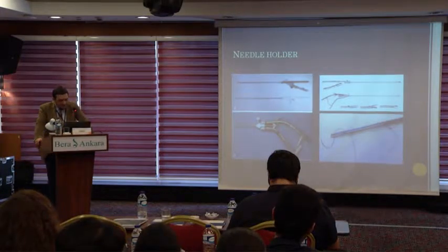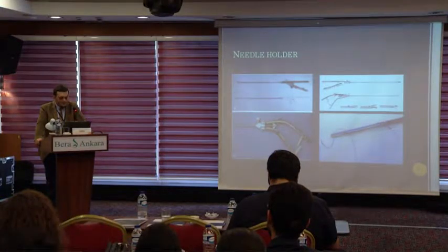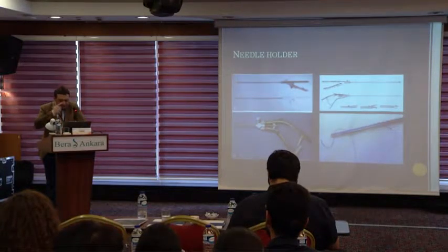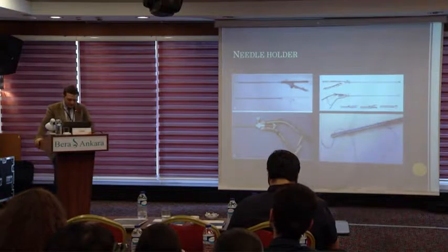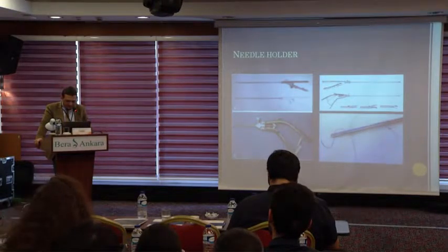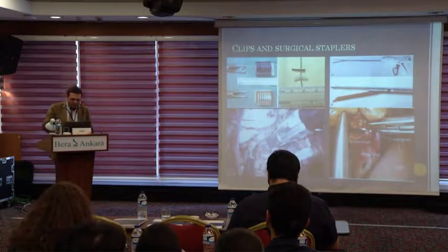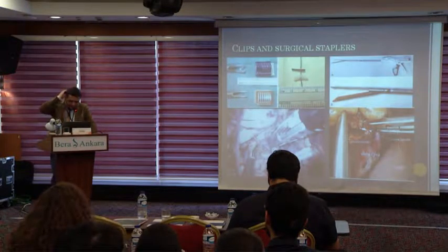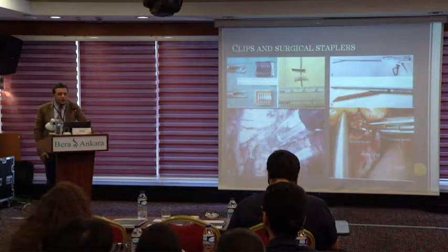Suturing and knot tying are the most difficult tasks in laparoscopic surgery. A significant amount of practice is needed to achieve a sufficient level of proficiency. In addition to standard rigid needle drivers, some companies have recently developed articulating needle holders that aid in obtaining more optimal suturing angles with the needle. There are various types of clips like titanium and polymer, such as Hem-o-lok clips.